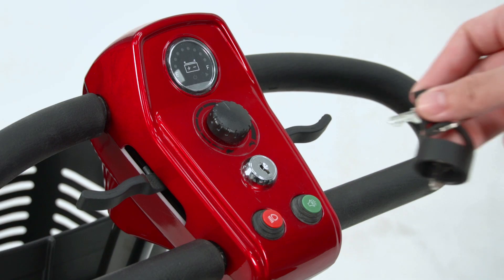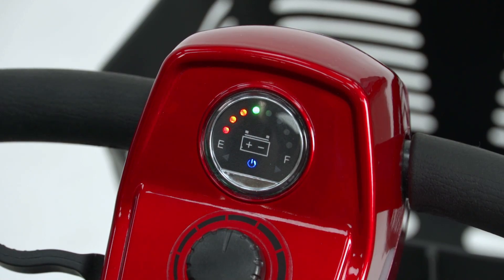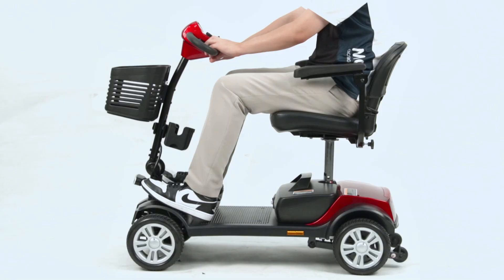How to use: First, slot in the key into the key ignition. Twist the key and the battery indicator will light up. Press the lever on the right to move forward and press the lever on the left to reverse.